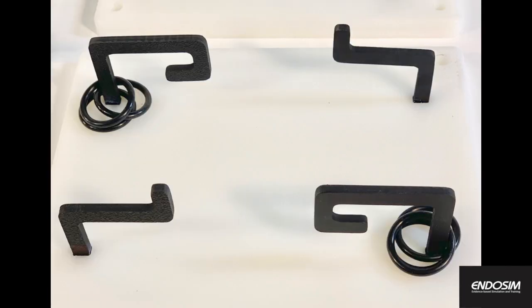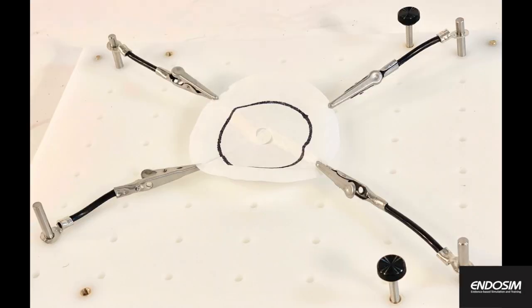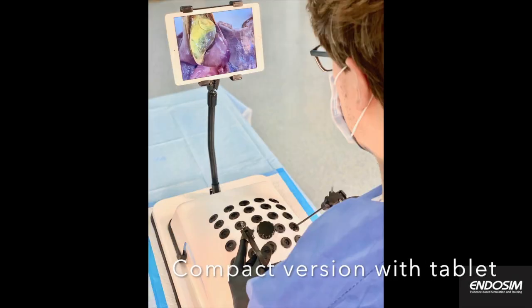Ex vivo gastrointestinal organ packages can be purchased from Endosim. They provide a realistic tactile feedback with the possibility to use commercially available laparoscopic instruments.